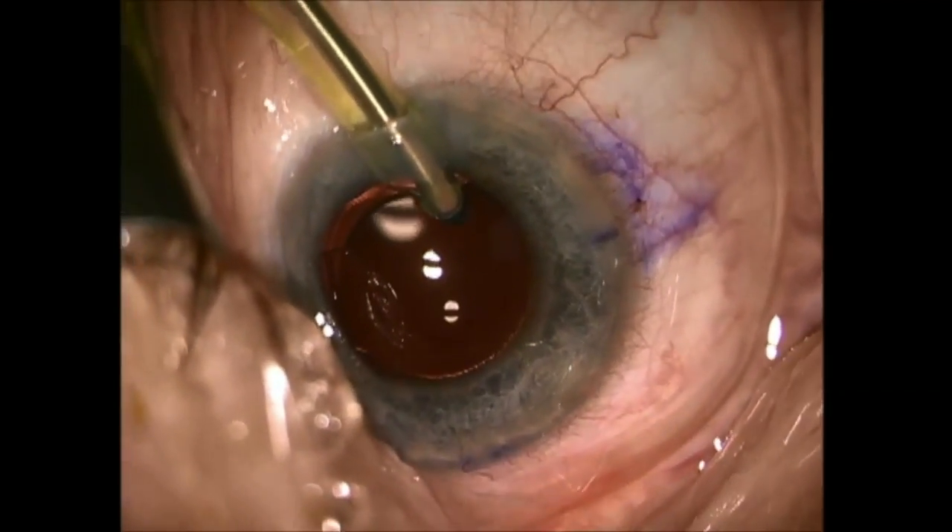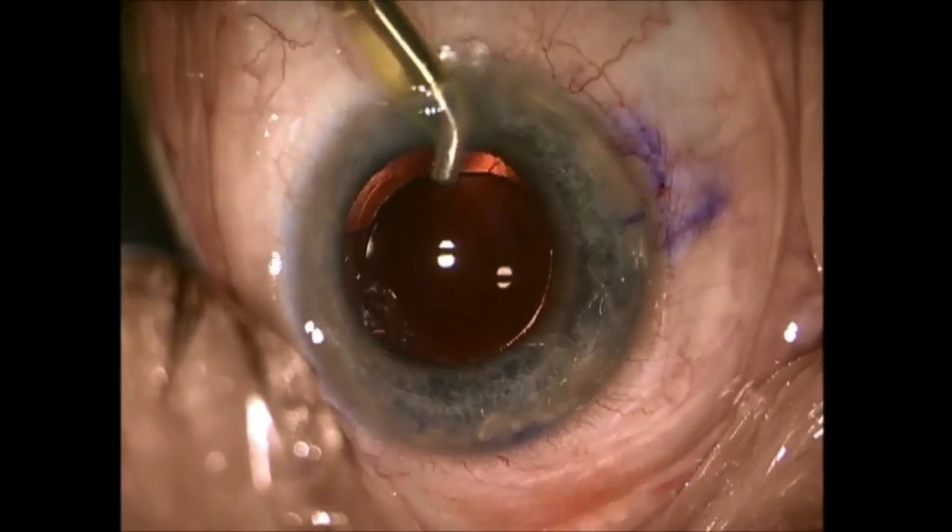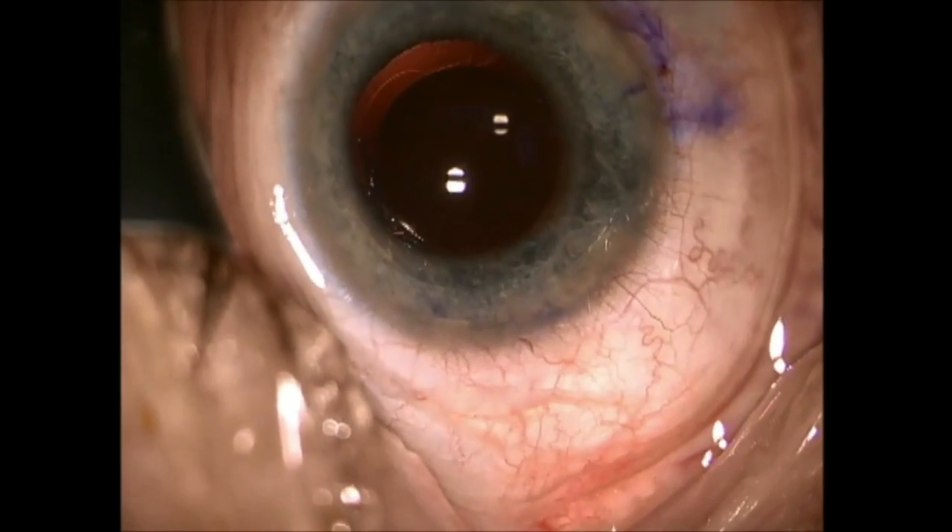Leaving the OVD in may lead to a pressure spike. At times, if there's some left over, I tilt up the optic and go under it.